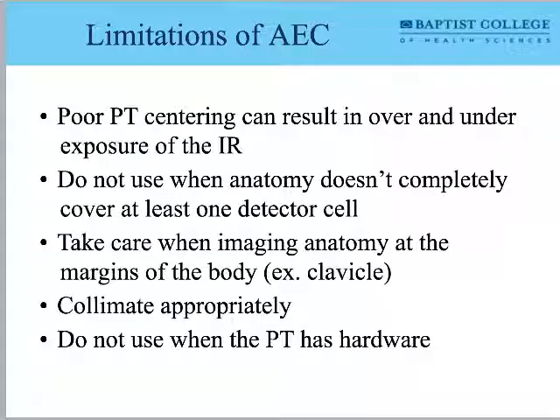So I would question the AEC's use on a frog leg lateral anytime. I don't think you need an AEC for that projection. You definitely, for example, don't need an AEC for an elbow, a wrist, or a hand, because think about it, there's no way that my hand can cover all of that ionization chamber. So it's not helping me there. Also, the technique is so low, I'm fighting the minimum response time.